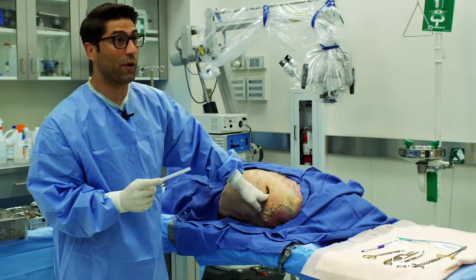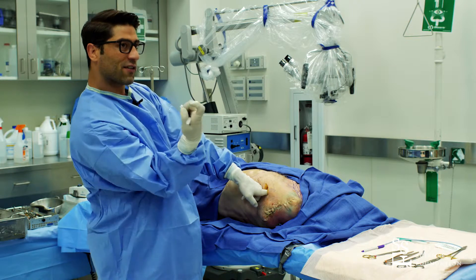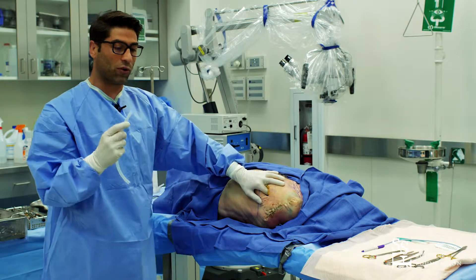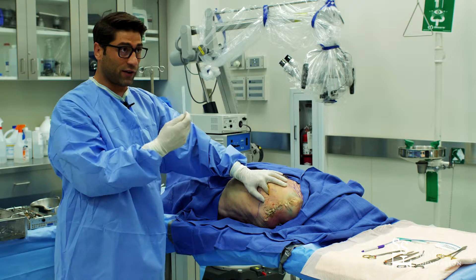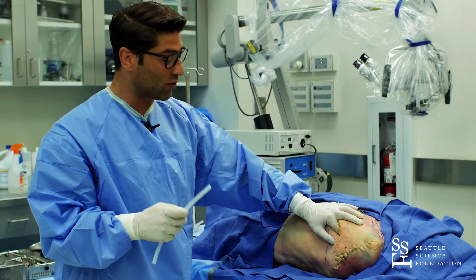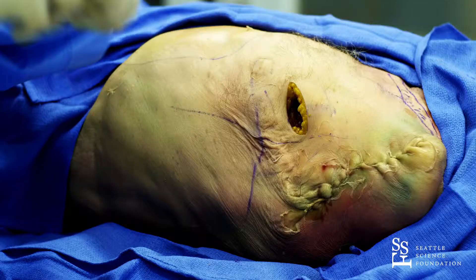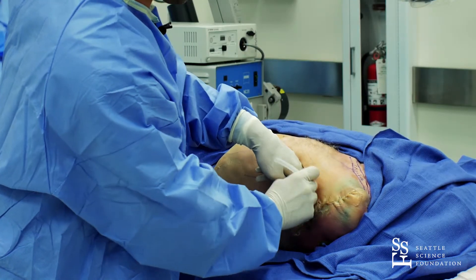Once I have the hole, I always recommend doing a 360-degree circle with your finger to make sure you're in the chest cavity, not the abdominal cavity, and you can feel the lung coming to the tip of your finger. Then you put the chest tube in depending on the pathology — when you have a pneumothorax you want the chest tube to be anterior because air rises, and when you have blood or pleural effusion you want it on the back side. I use my finger as guidance to put the chest tube exactly to the space where I want it.